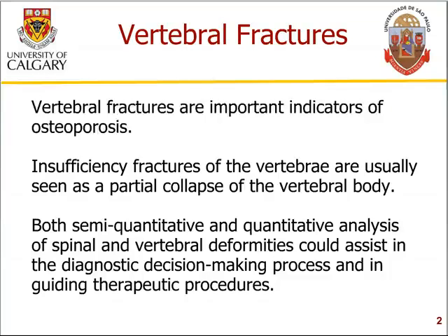The main interest in this project is on the detection and analysis of compression fractures in vertebrae. Vertebral fractures are important indicators of a few conditions and diseases, including osteoporosis, and insufficiency fractures are usually seen as a partial collapse of some of the vertebral bodies.